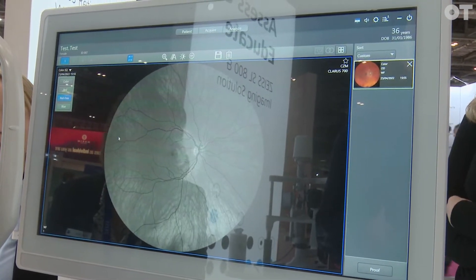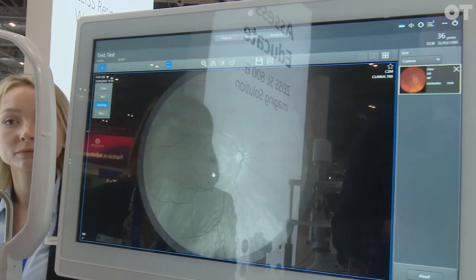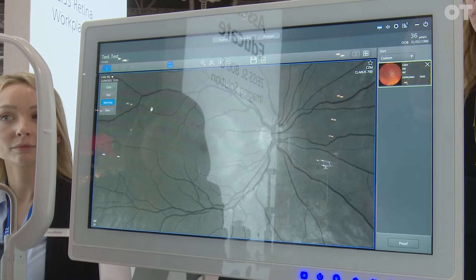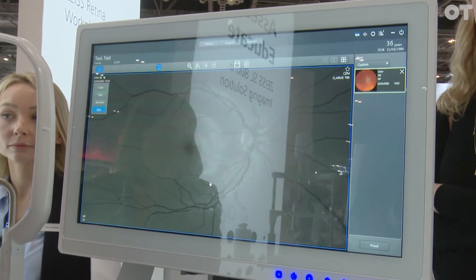We can also switch to the red-free channel, which just shows you the vasculature on the surface. It's great for diabetic patients or any patients with vein occlusions. Again, we can zoom right in and you can see how clear and crisp these vessels are — it's a high-resolution image. We've also got the blue color channel, which is for the anterior layers of your retina, such as the retinal nerve fiber layer.